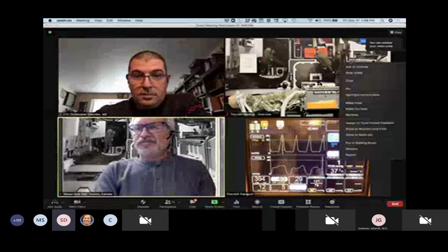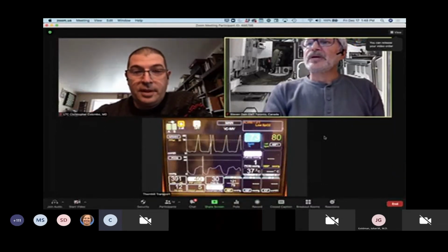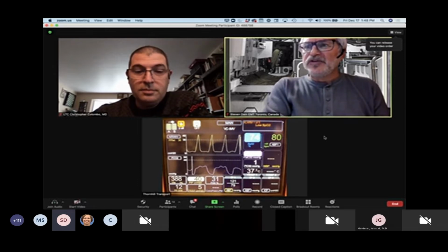Absolutely. I see that SAT dropping in the consult on the Omnicare app. Are you able to make the changes on the ventilator if I can make suggestions, or would you like me to make the changes for you? Yeah, I'm not familiar with this device. It's not one I normally use. If you could make the changes, that would be great.